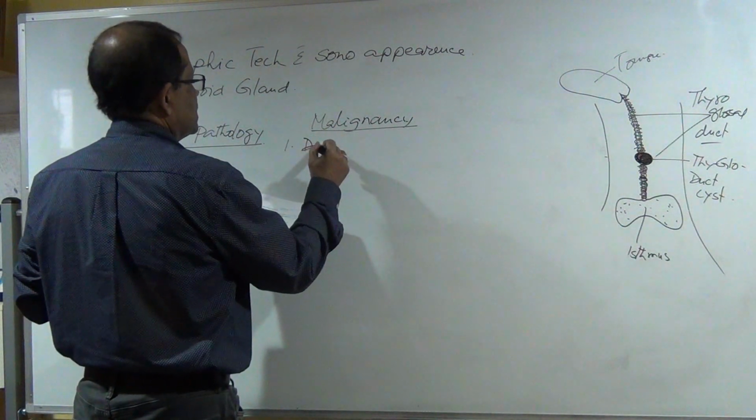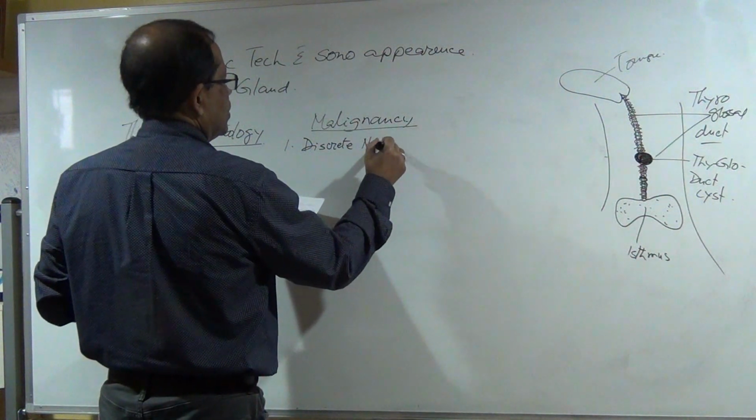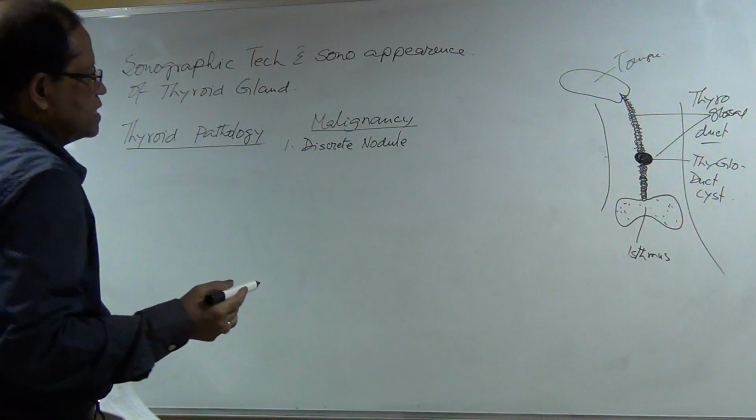It is a discrete nodule, means isolated discrete nodule.